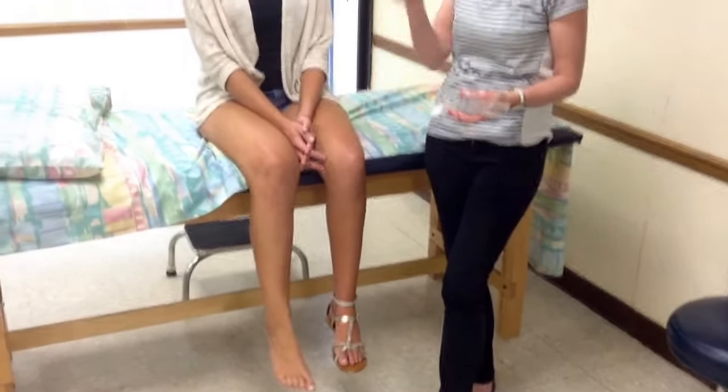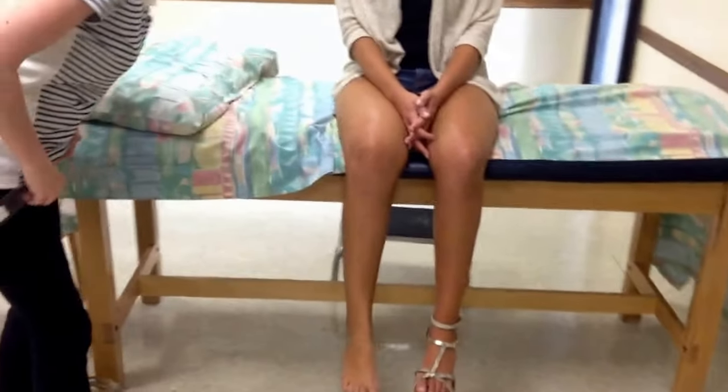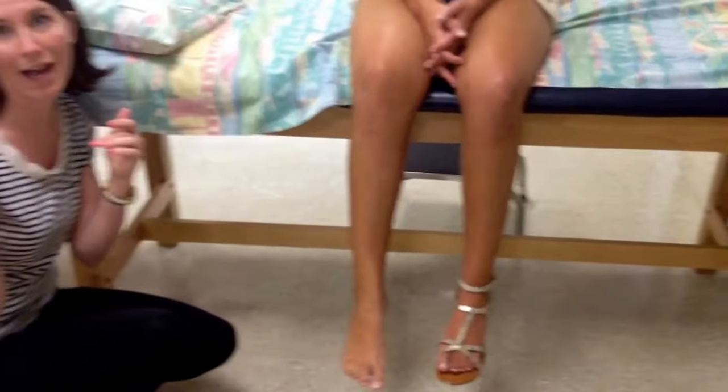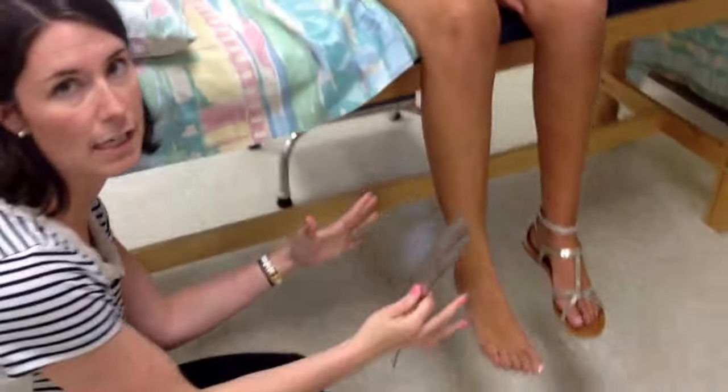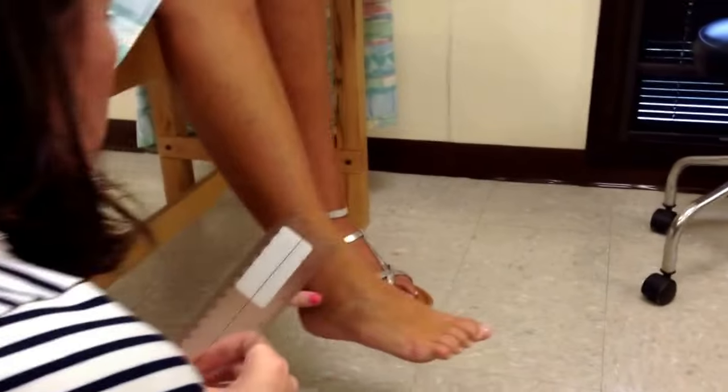The patient is going to be short sitting as she is on the bed here. I need to be to the side of her. Her shoe and sock are off so that I can see. You might want to come over behind me, Monica, so you can actually see the goniometer.